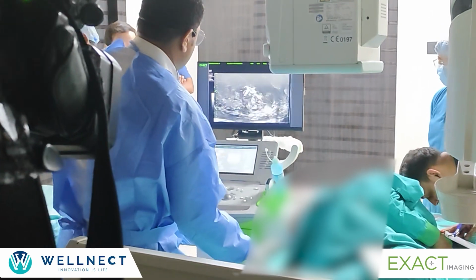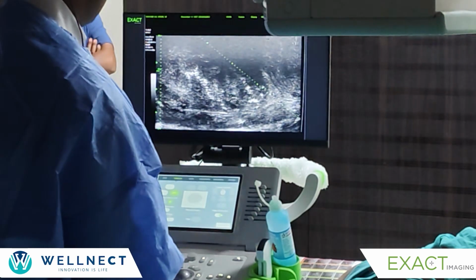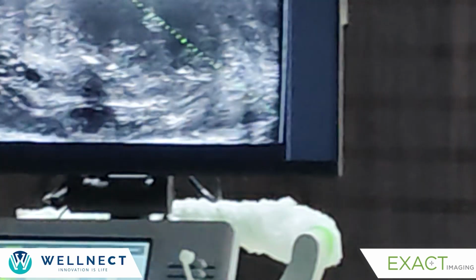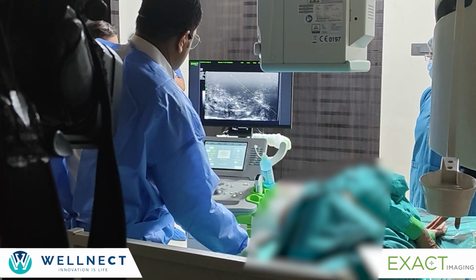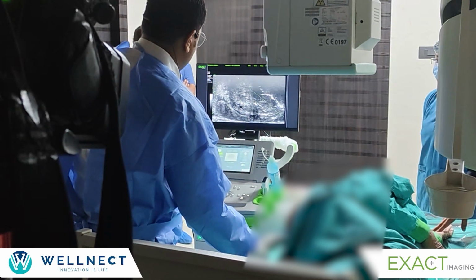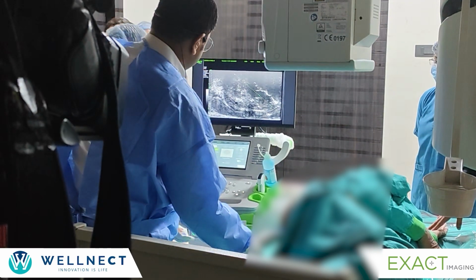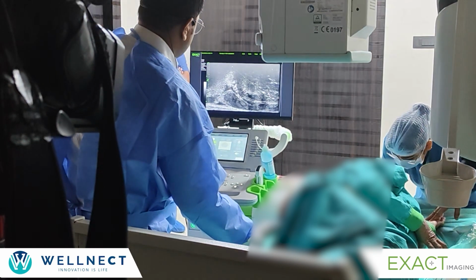Okay. Now again I come to the apex. This is the complete left side. After this, there is no prostate. So this is left apex lateral. Understood? Yes. And this is the sphincter. This is the sphincter area. This is the apex of the prostate. So this is through this, and this is the apex left lateral. This is midline left lateral. And then this is the base left lateral.